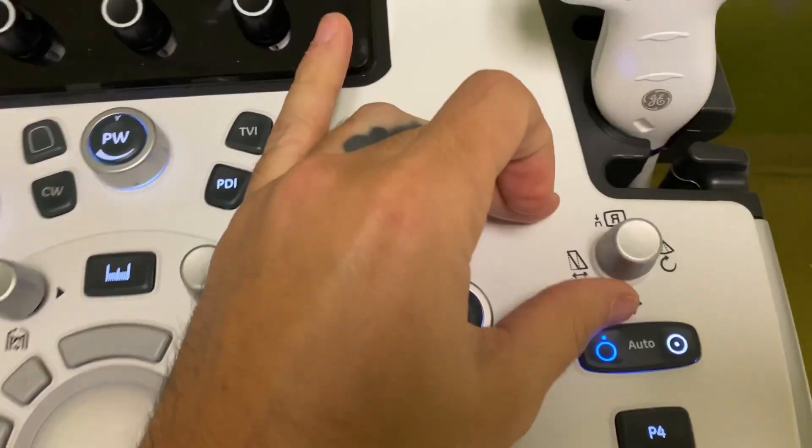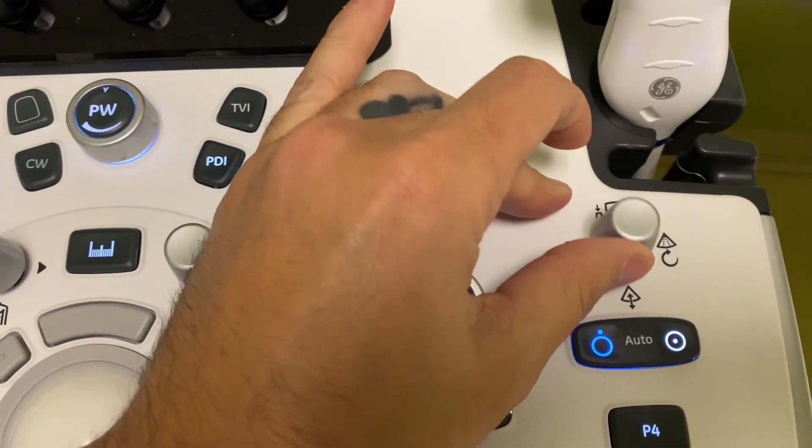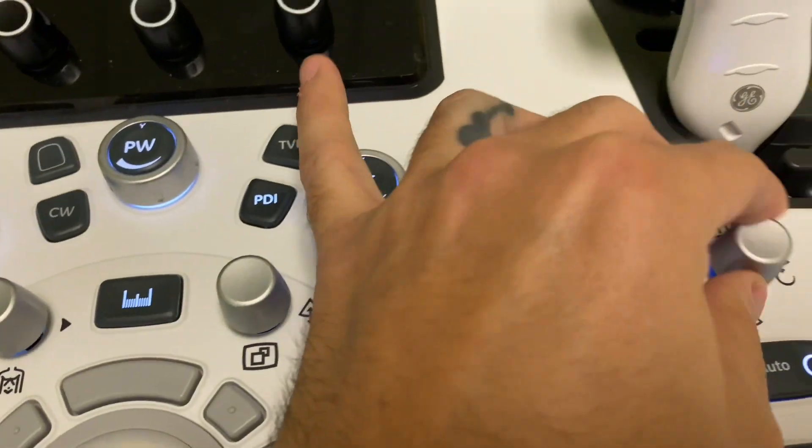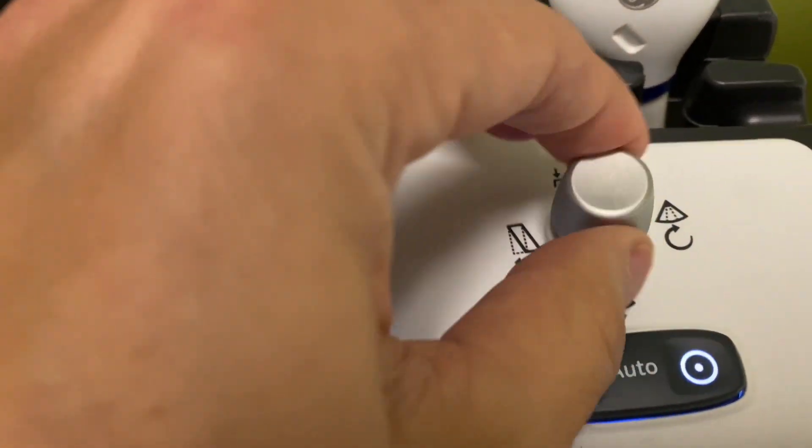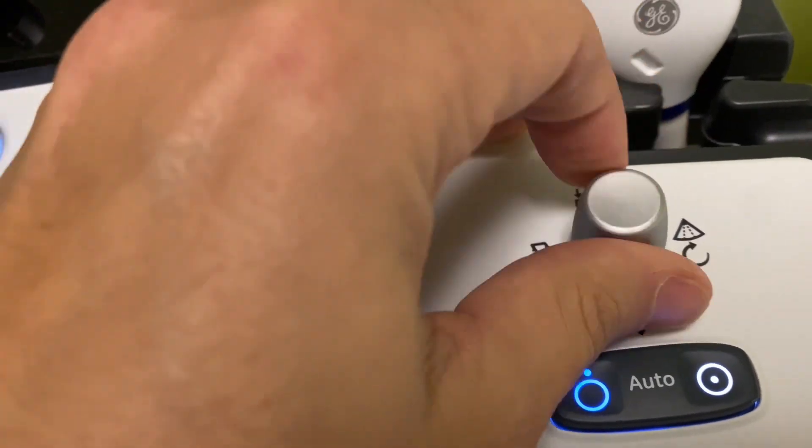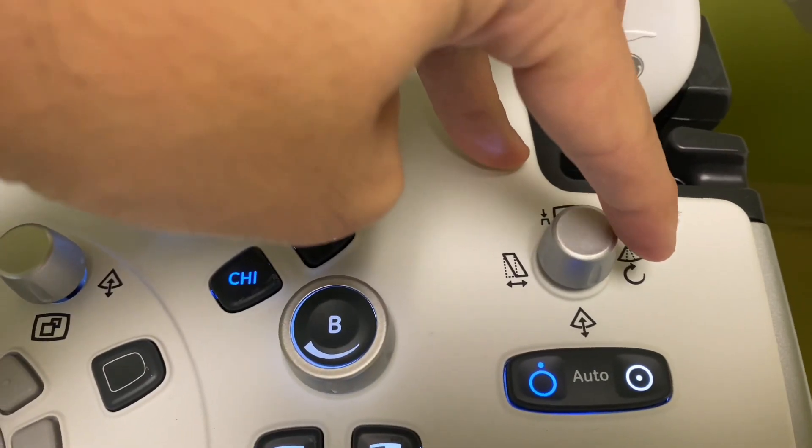Okay, this knob is for depth. So if you want to go shallower, you go up. If you want to go deeper, you go down. And then it also has, if you twist it, you can narrow your field of view or make it wider. And then if you turn to the right, you can steer. I never really use the steering, but I do use the zooming up a lot.